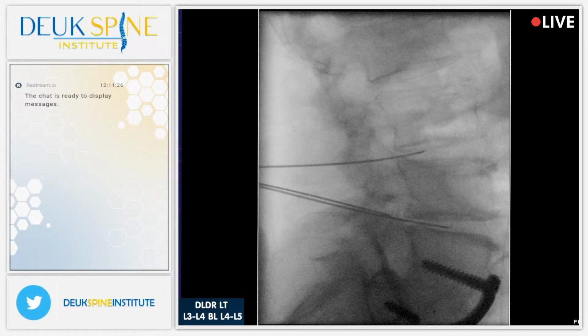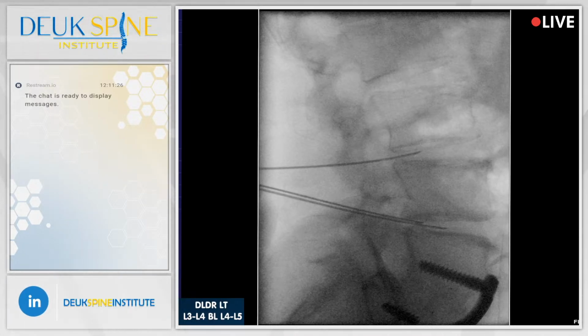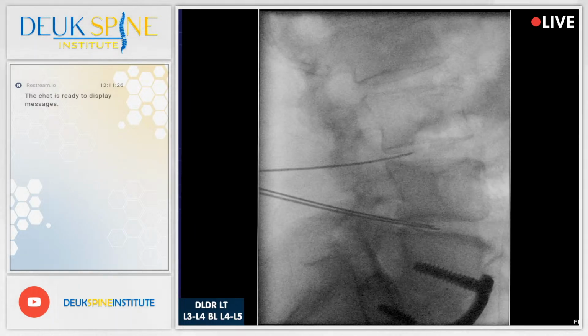Can you feel anything? What do you feel? Back? Where are you feeling it? He's feeling it in the back. Nothing down your leg, right? He said, no, sir. All right, you're doing great, by the way. We're almost done. I know it hurts, but this is those bad discs that we're here to fix, okay? You understand? All right. So, are you comfortable now?